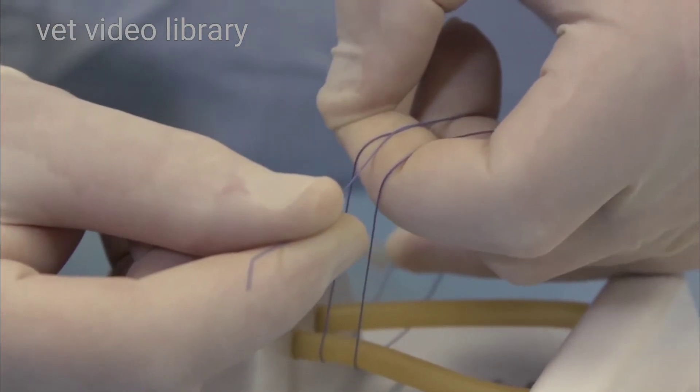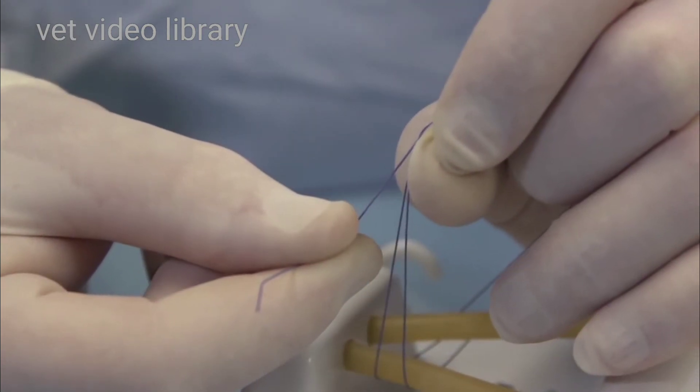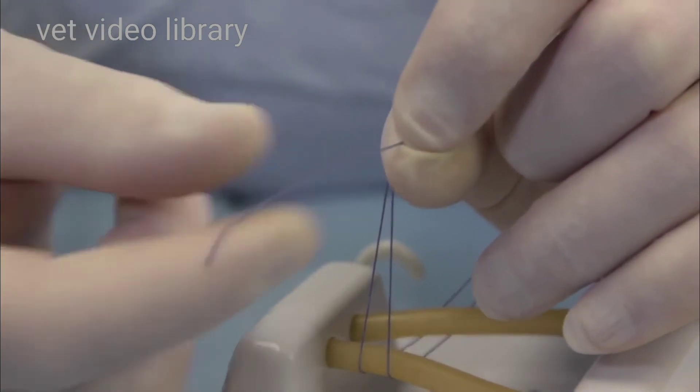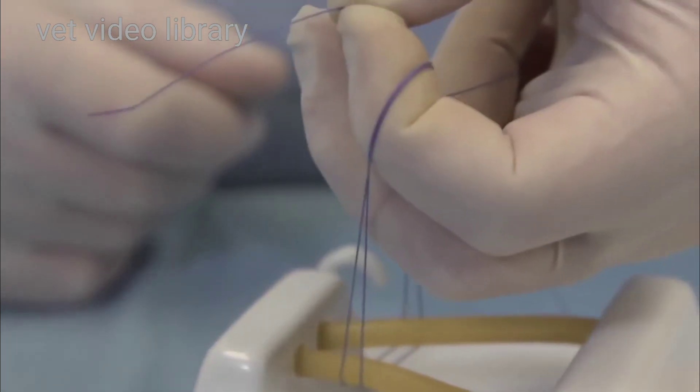I'm going to flip everything from my index finger onto my thumb like that. I'm going to take this loose end, I'm going to pinch it between my thumb and my finger. I'm going to pull it through like that.